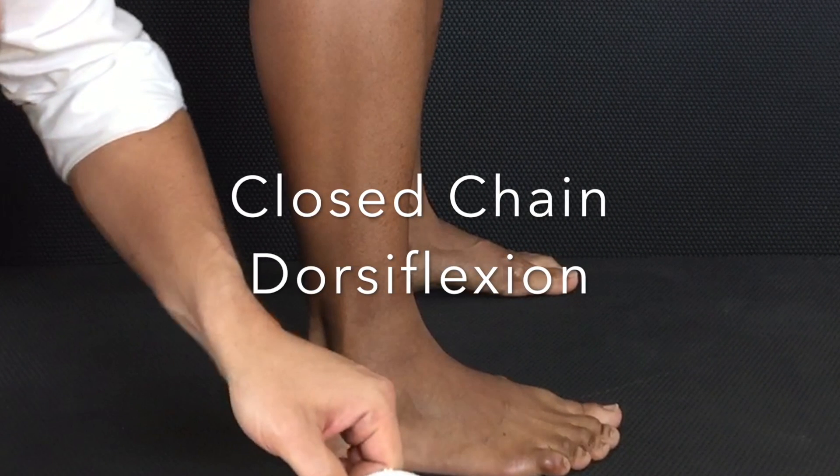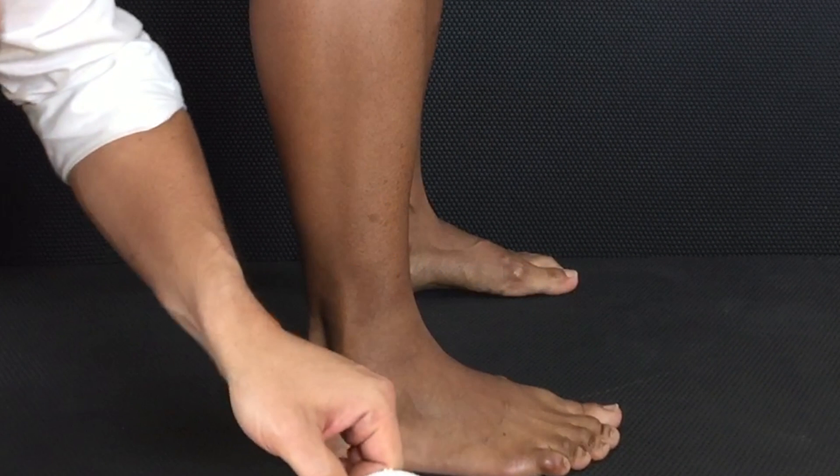For closed chain dorsiflexion, we want to use an inclinometer. To get it zeroed properly, we put it at 90 degrees on the floor. That way when we flip it up onto the leg, it will be at zero degrees. If you want to zero it on the wall, then you would zero actually at zero degrees.